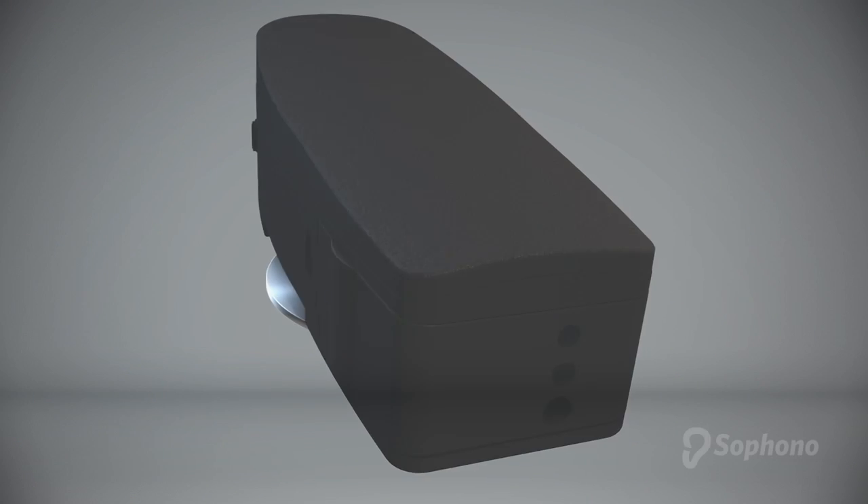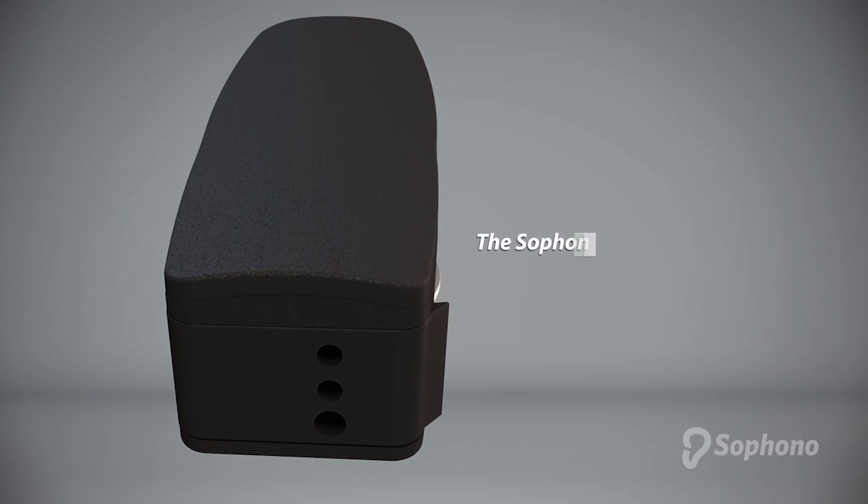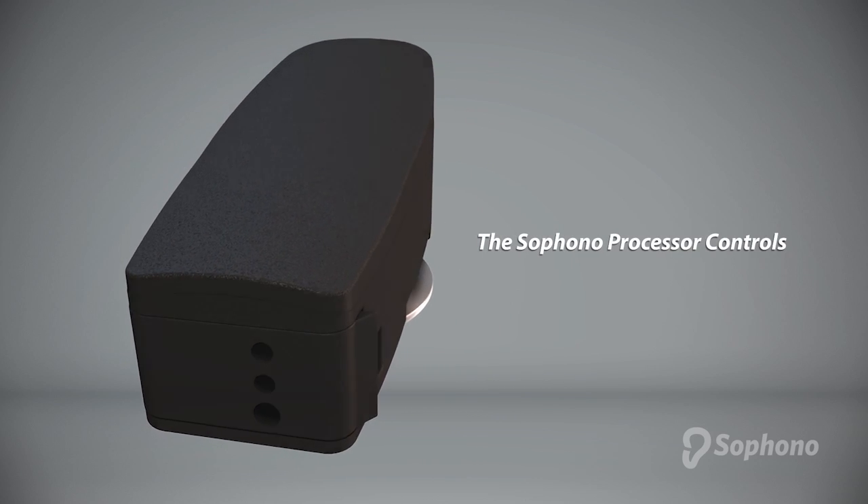The Sophono device is the lightest bone conduction audio processor on the market. This video explains the controls on the Sophono processor.